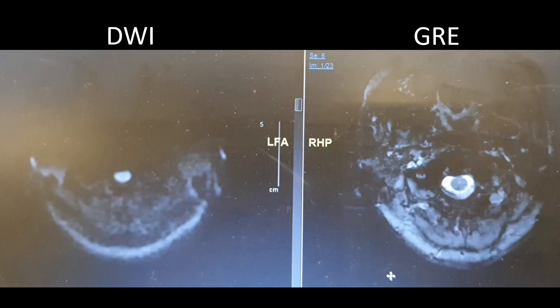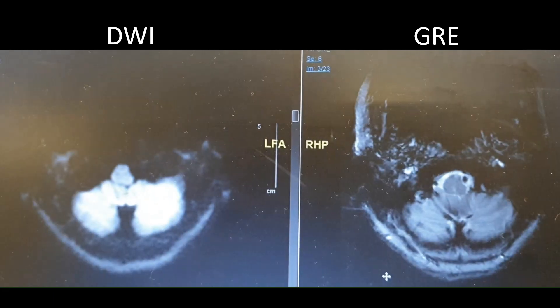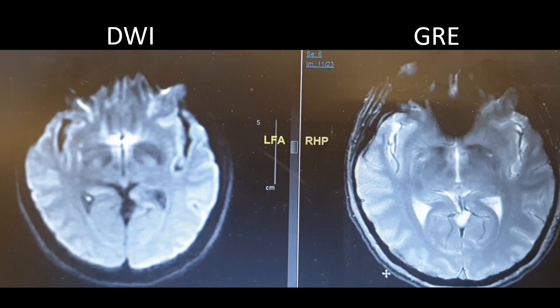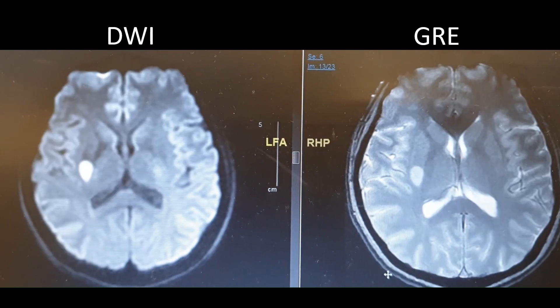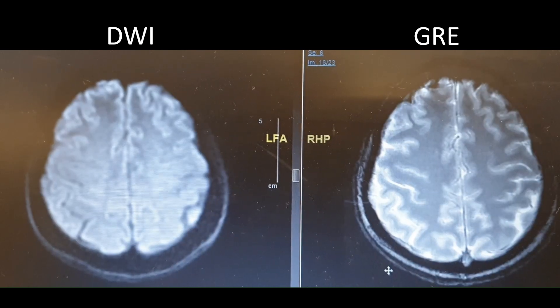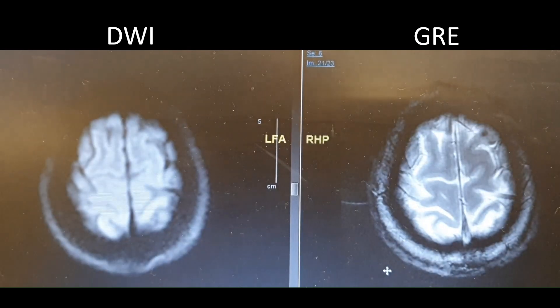The image on the left is the DWI sequence and on the right is the GRE. Concentrate on the region of interest, which is the right putaminal infarct. If you see anything dark within the area or region of infarction on GRE, this may suggest hemorrhagic transformation. In this case, the GRE on the right did not show any hemorrhagic transformation.